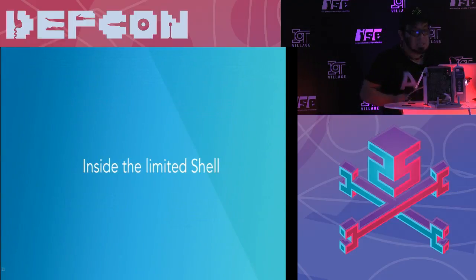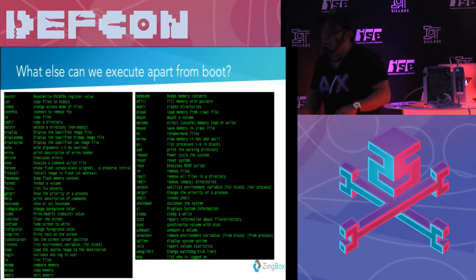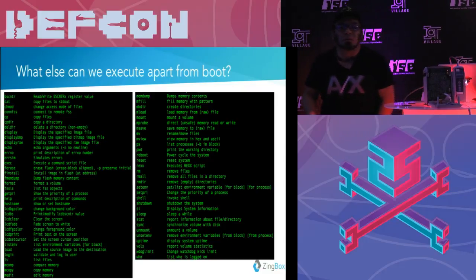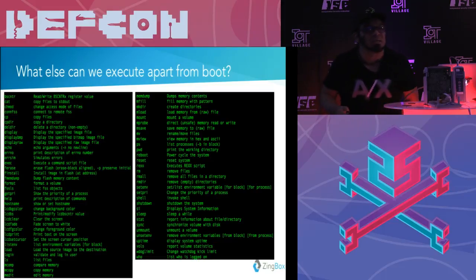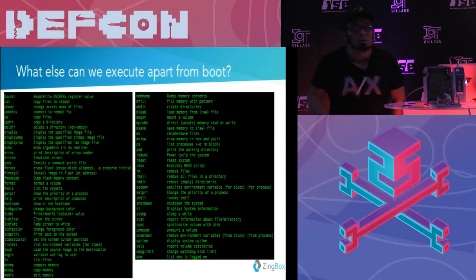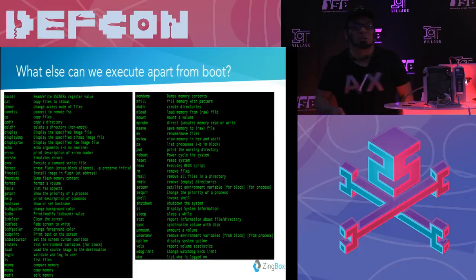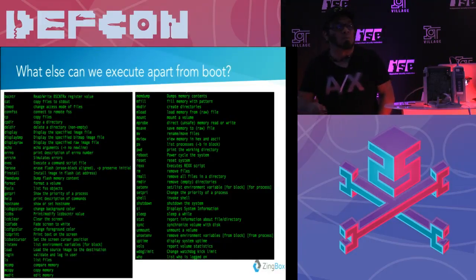So let's move to the next one. So here are some commands that are found that you can use. It's basic Unix-related commands, but those Unix commands can help you to do a lot of stuff. So you can do mem copies, you can do formats, you can do mem dumps, you can dump the flash, you can run scripts. This one specifically here is the Rex scripting language. I don't know if you guys have heard about Rex scripting language before. It's like Perl, but I never heard of it before. It's one of those weird things running in these kinds of devices. But that one can help us to actually do more stuff because we don't need to play with ASM assembly. We can play with just a script, like a Perl script.